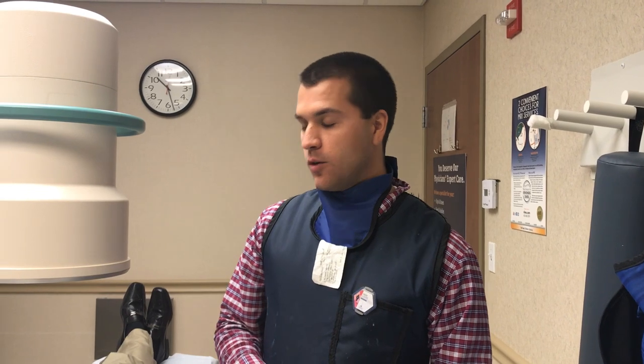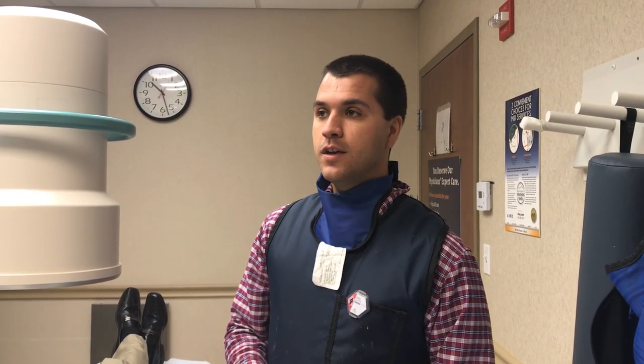My name is Dagen Cloutier, editor of the JBGS Journal of Orthopedics for Physician Assistants, and we'll be taking a video of a fluoroscopic-guided intra-articular injection of the right shoulder. It's a 50-year-old gentleman with adhesive capsulitis, and we're going to be doing a steroid injection today.